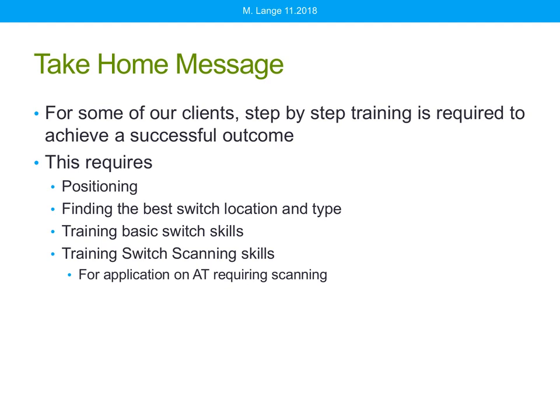I want to make sure we quickly get to our take-home message here. For some of our clients, step-by-step training is required to achieve a successful outcome, and that means I can use my scanning successfully. This requires that the client is well-positioned, because when they're well-positioned, we can find the very best switch location and type. We can train basic switch skills, which we discussed in our last webinar in October, and again, you can access that if you would like to.